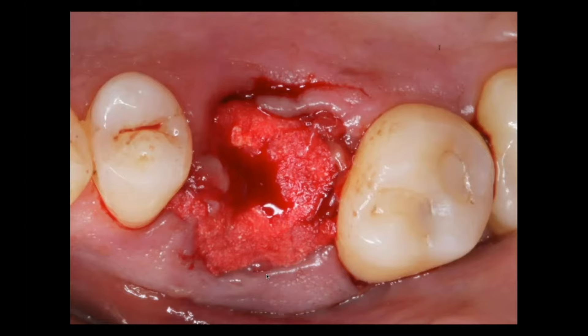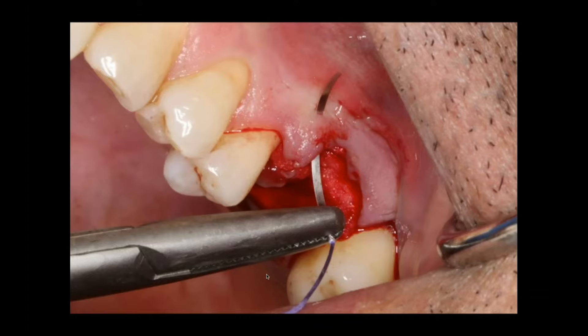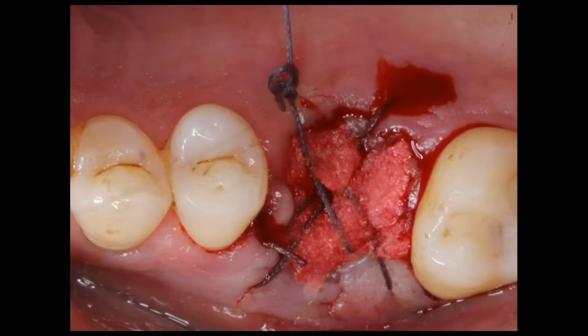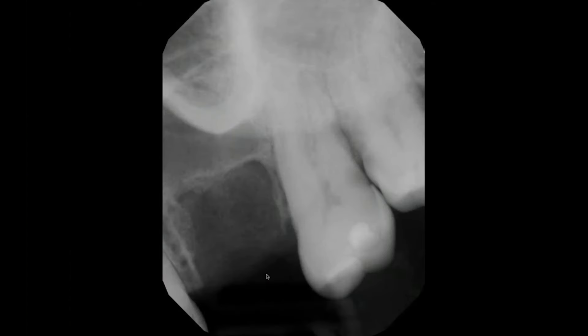I'm going to pack this material firmly — we're not crushing it, it's not amalgam — but I want to pack the material firmly to the crest of the ridge. There's no membrane involved here, so I'll just put a couple of simple interrupted sutures. I'm taking my needle, which is a reverse cutting needle, from the crest, and I'm actually penetrating through the facial tissue, eliminating grabbing onto the graft material. I'm going to turn the needle around and do the same thing — go from the crest of the socket to the palatal — and simply do some cross-sutures to maintain that graft material into the site.